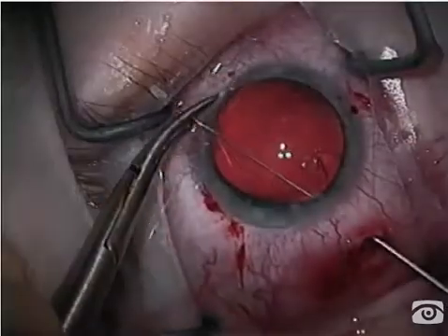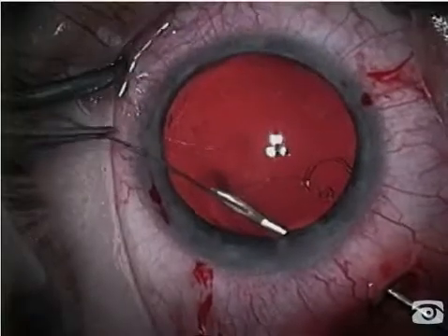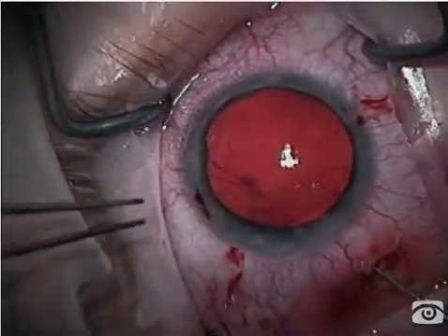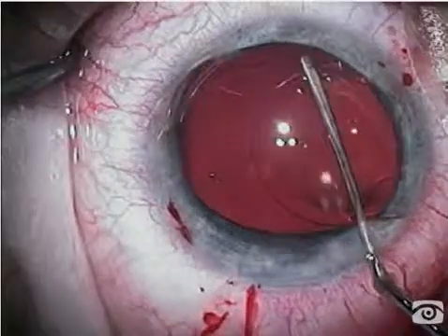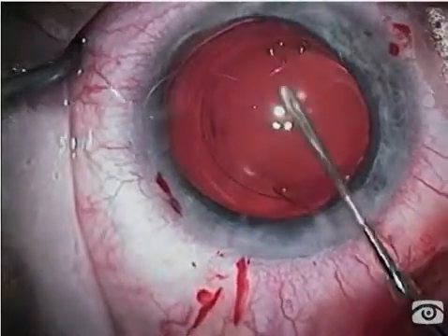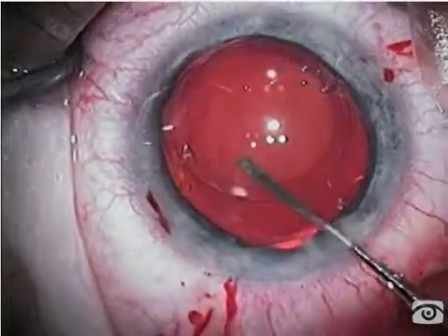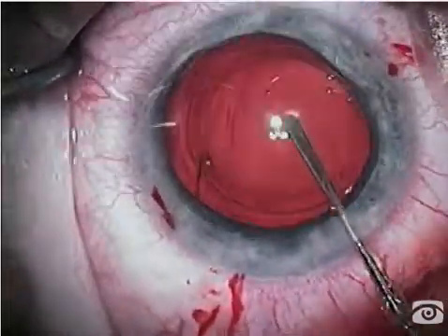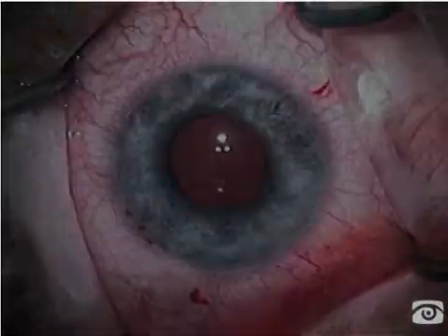I'm now positioning the eyelet in an oblique fashion, using two double-arm trans-scleral needles with 9-0 prolene. We'll fixate this to the sulcus, and then I will place a three-piece longer foldable IOL in the sulcus before bringing the pupil down with Miochol. This patient now has a normal depth to her anterior chamber and a normal refractive error.